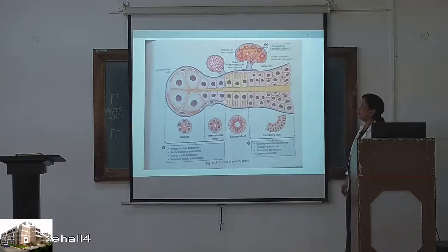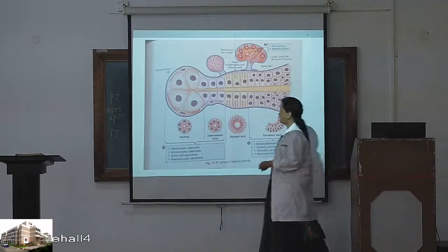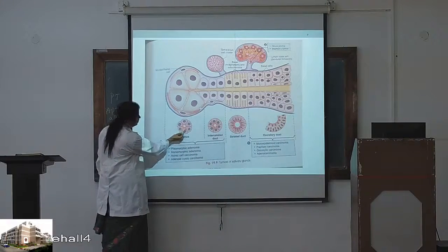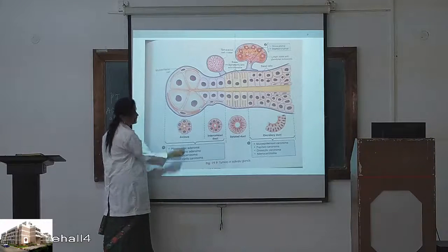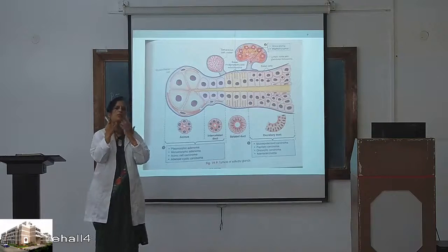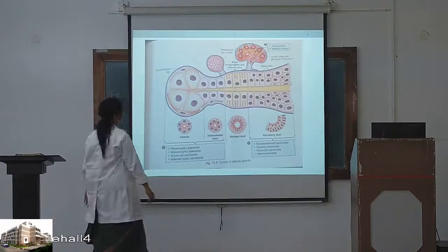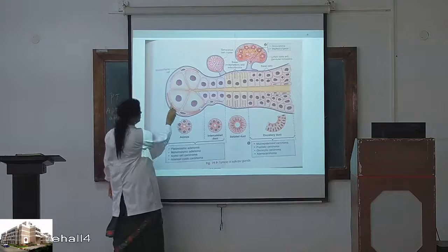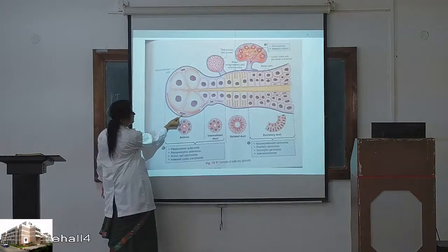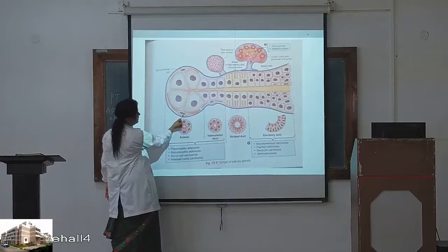Remember this histology? Salivary gland. This is the acinus. See, the acinus has cuboidal to columnar cells, and the type of cells varies with the salivary gland: serous, seromucinous, mucinous, right? And can you make out there is an outer layer of cells? This is the myoepithelial cell. So, epithelial cell, myoepithelial cell.